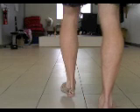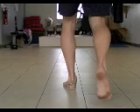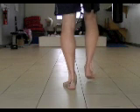With the second long lever strip in place, we can see that the foot is oriented more vertically and these effects are even more pronounced.